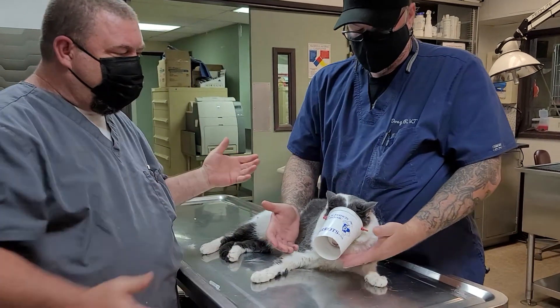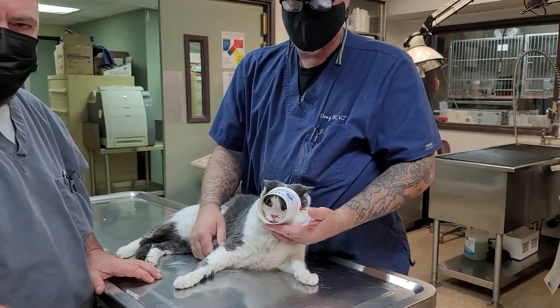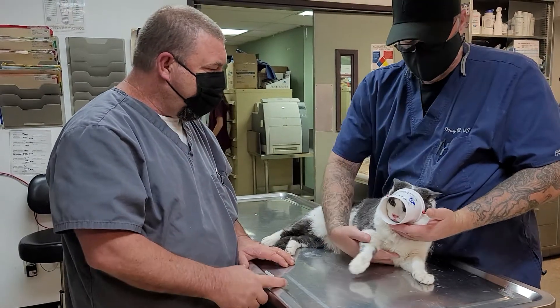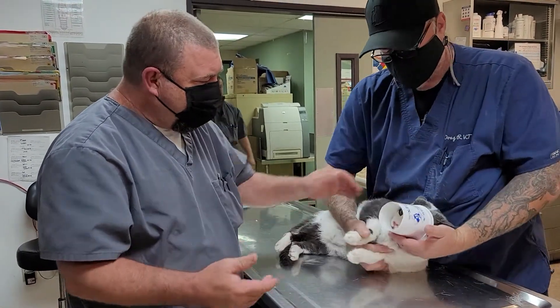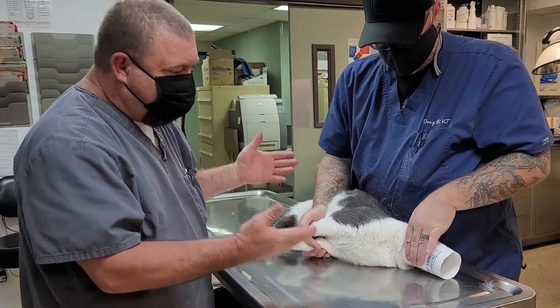They don't react negatively to these muzzles. They can still see. You can use it for small animals that are having respiratory difficulty and need to take radiographs, or for fearful animals. It just works so much better.